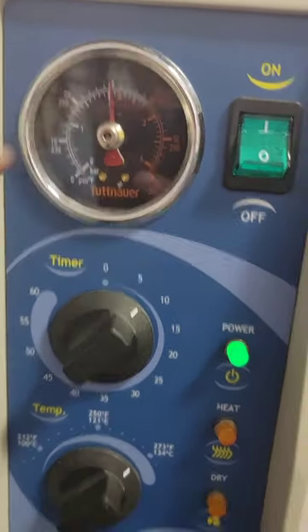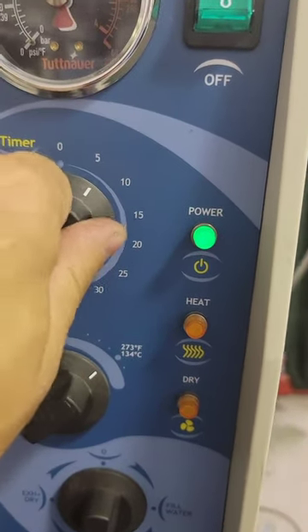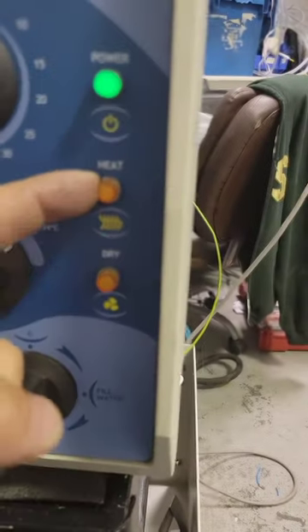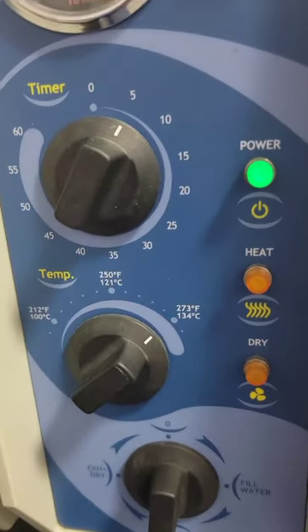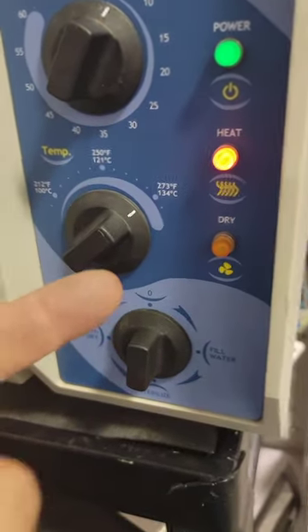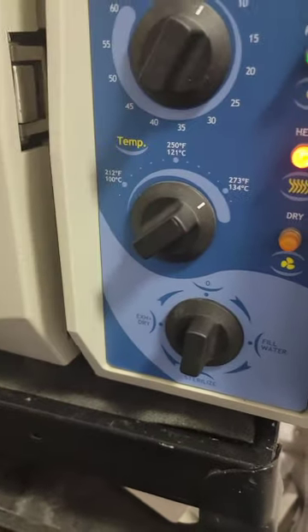We're now at our desired temperature and pressure. For a five-minute cycle — it's analog, so you've got to guesstimate — there's your five. Notice the heat light is off. The way it works to keep it at a set temperature: when it reaches temperature, it turns off; it goes below a certain point, it turns back on; when it reaches back up, it turns off. It just cycles back and forth like that.